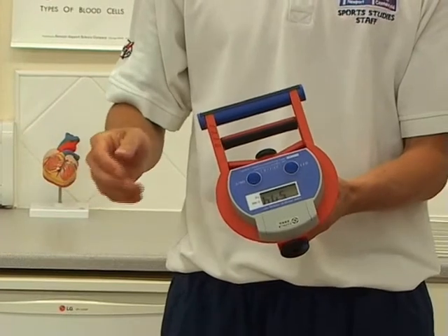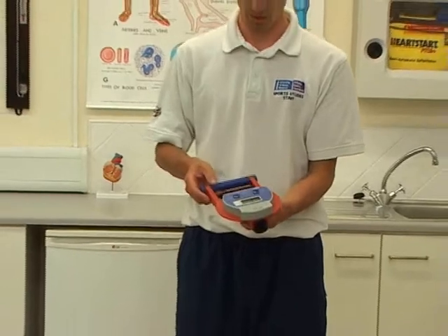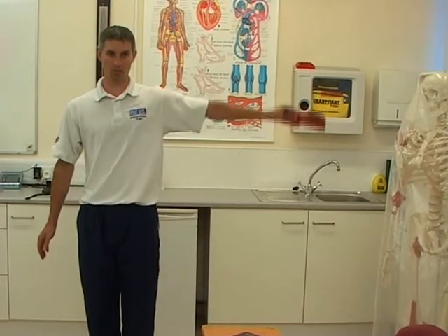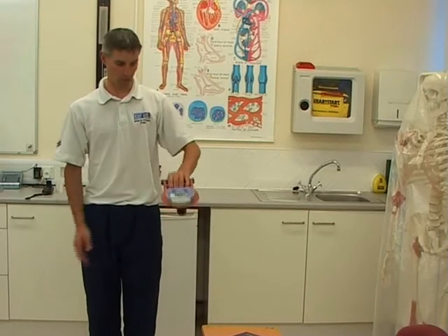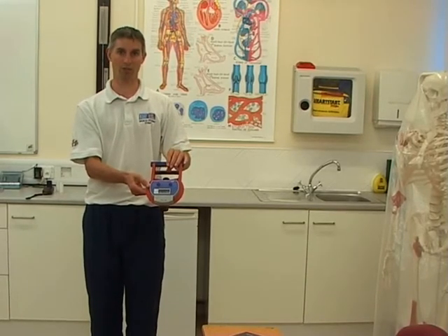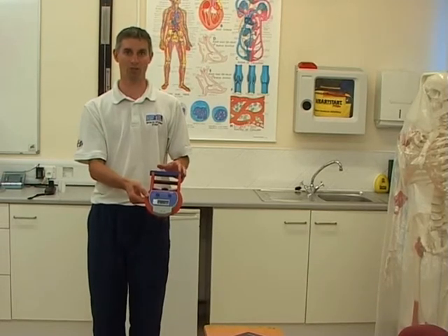Repeat this process three times on your right arm and three times on your left arm, but alternate between each so that there is less fatigue. Reset, move to your left arm, anatomical standing position, raise to the side, and squeeze. We have a second reading: 48.1. You may notice a difference between your right hand readings and your left hand readings — this is common if you're right or left handed. To complete, take three readings on each arm and record your highest value.